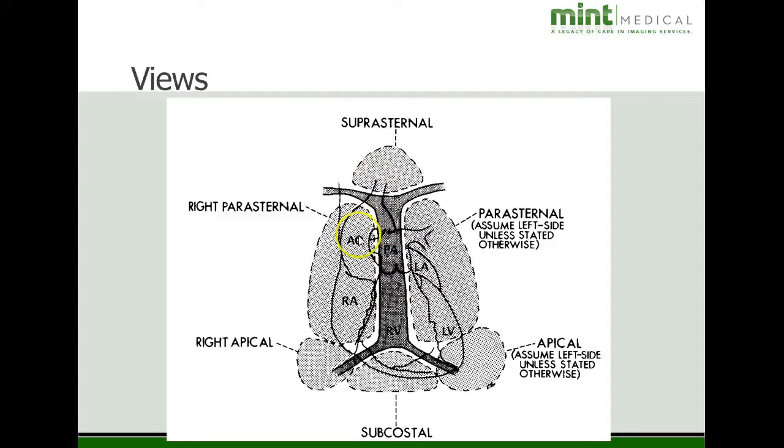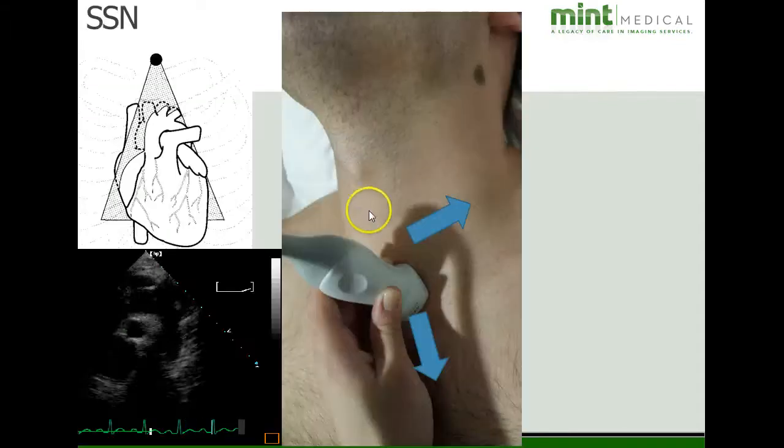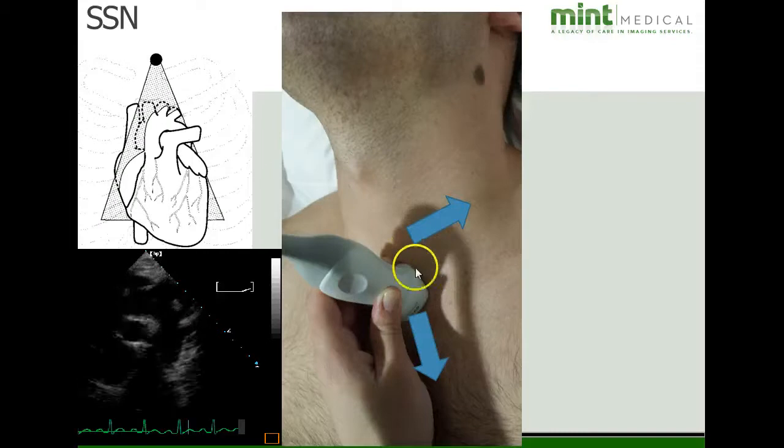And what we're going to be able to see in our images is a portion of the ascending aorta, transverse, and the descending aorta. So here's the slice from the transducer position is going to be basically positioned about 1 o'clock on the patient.